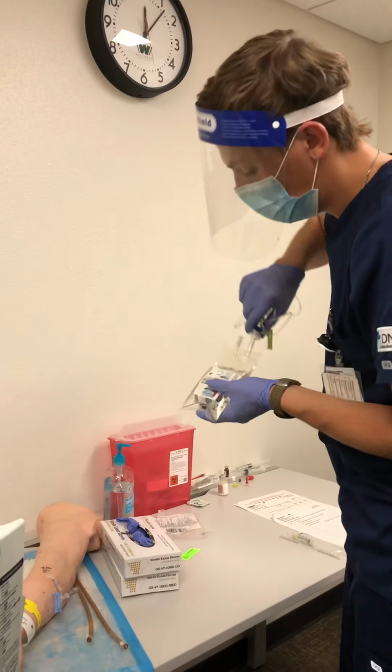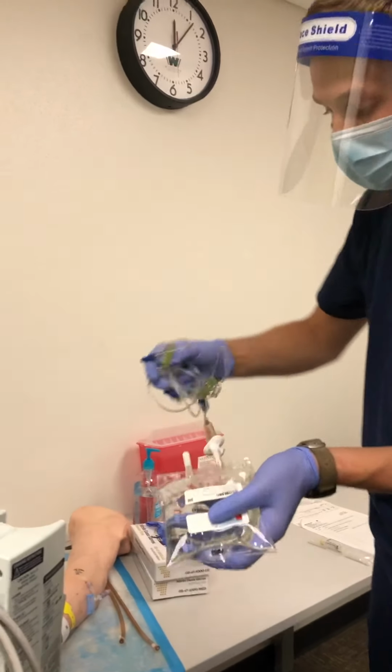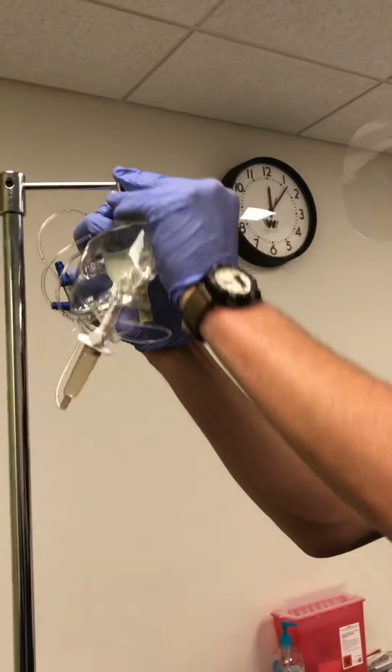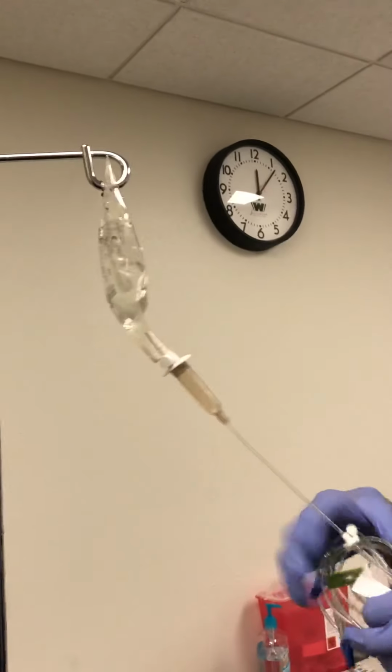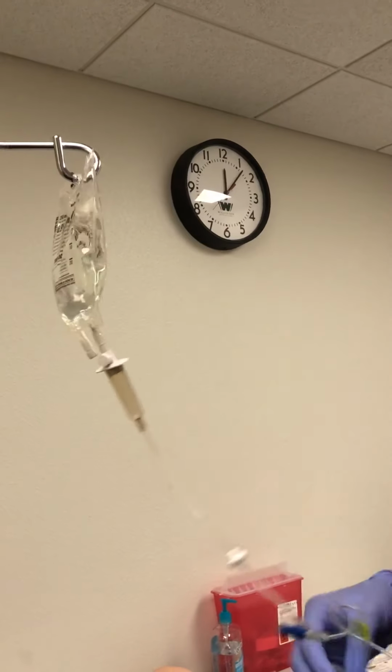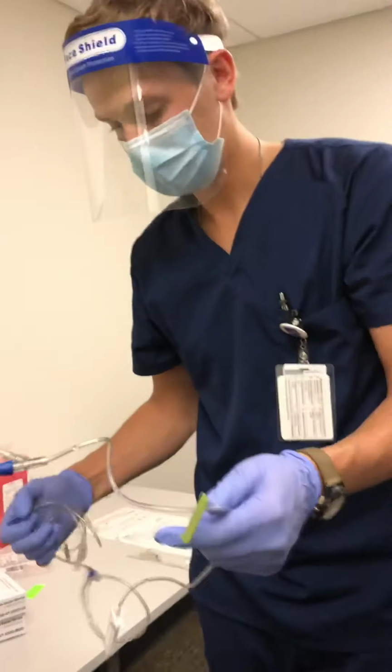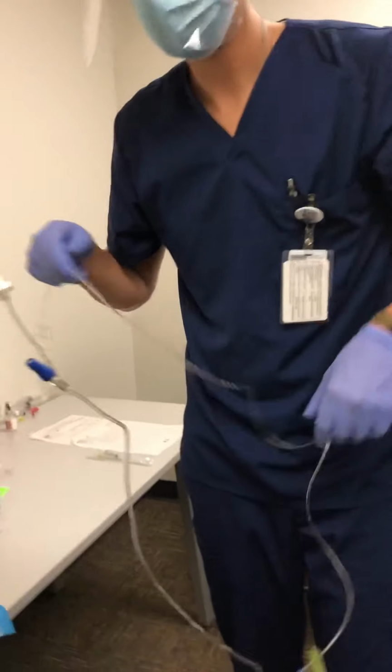Spike is in. We go ahead and hang it. Unravel this. It is still locked, so there's no flowing just yet.